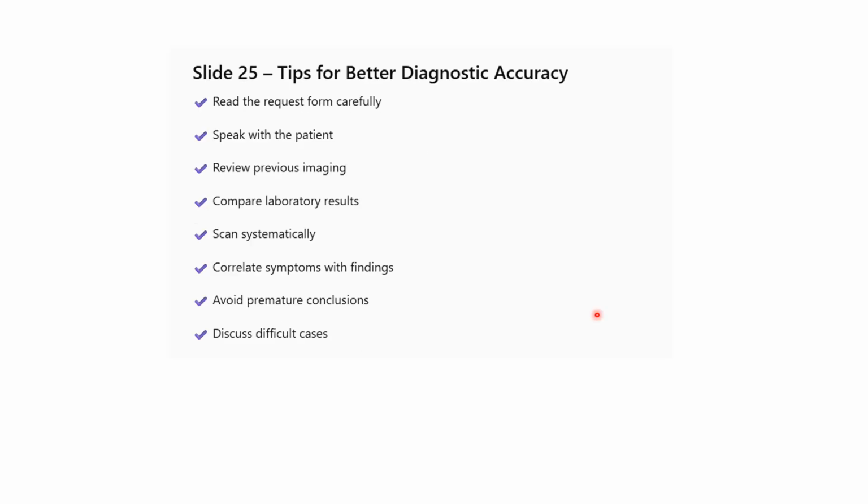So the tips for better diagnostic accuracy: read the request form carefully, speak with the patient, review previous imaging, compare laboratory results, scan systematically, correlate symptoms with findings, avoid premature conclusions, and discuss difficult cases.